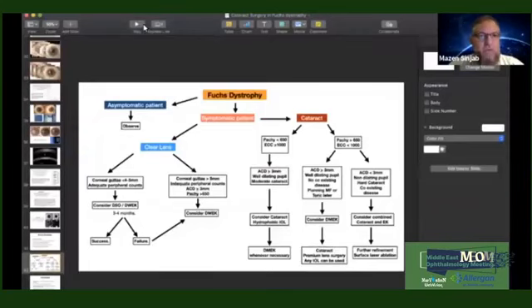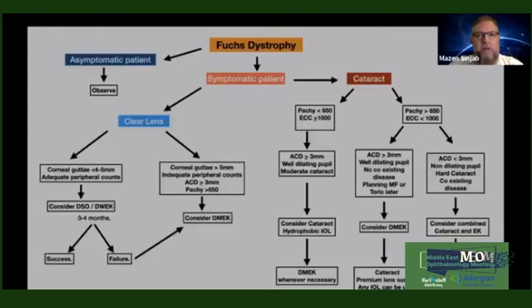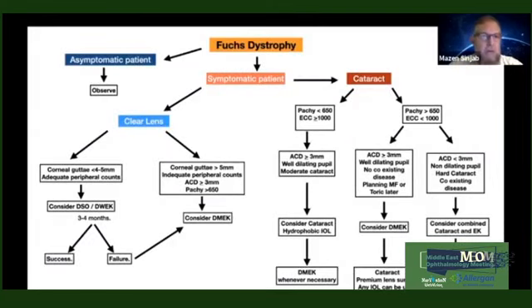Okay, Dr. Mazen? Yeah, I would like to highlight 2 points actually in such patients. The first thing is the IOL calculation, which will lead me then to the second point. In the IOL calculation, we have to consider that there will be a hyperopic shift after such operations, after the DMEK, for example, or DSEK.